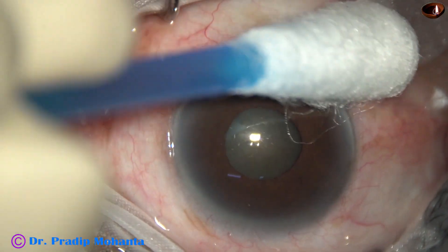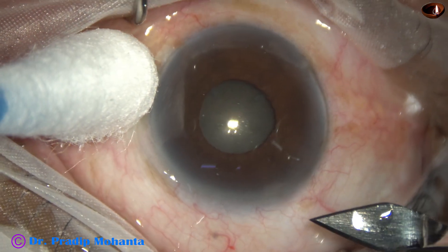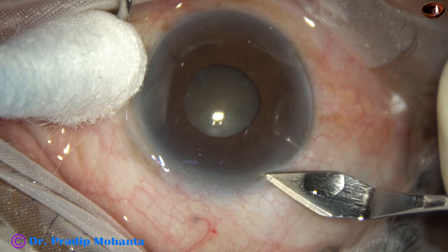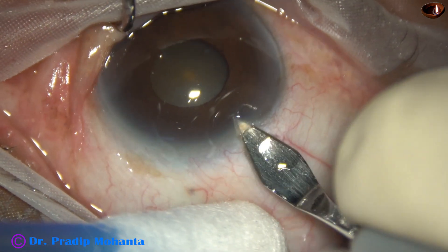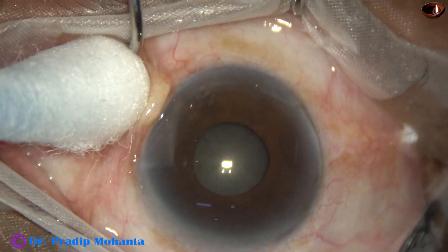This is a cataract with a very small pupil. You can see the size of the pupil is maybe 3 millimeters or even less, maybe 2.75 millimeters. We have applied all kinds of mydriatics but the pupil did not dilate.